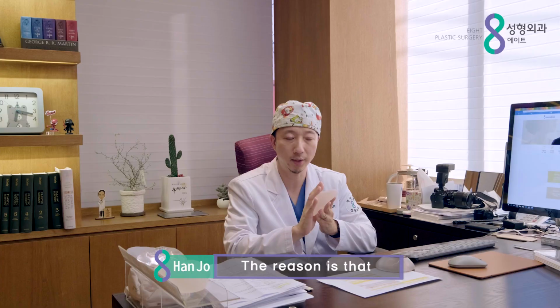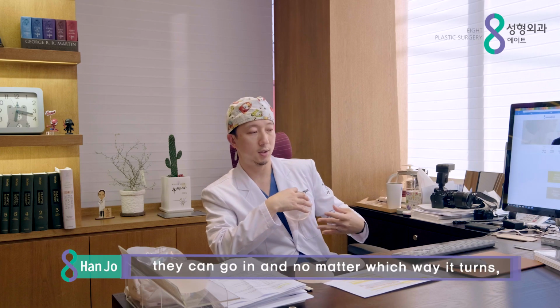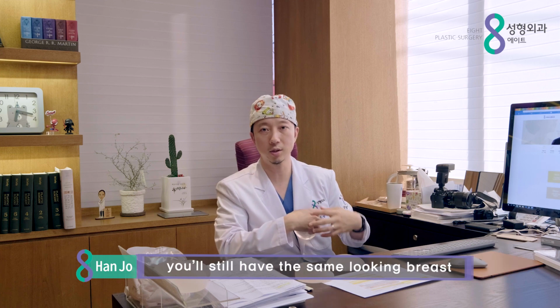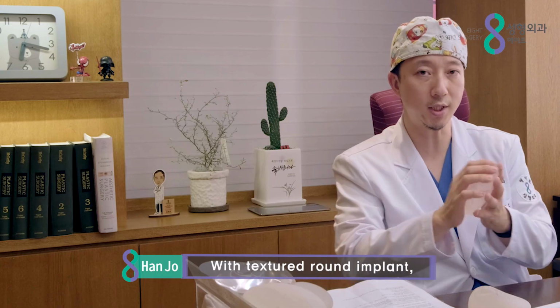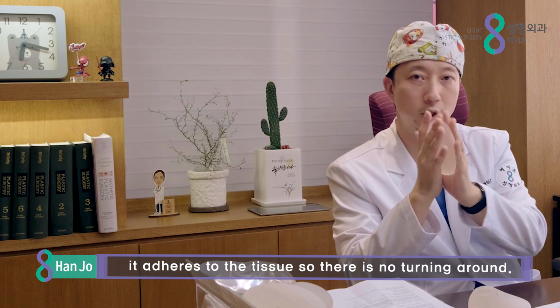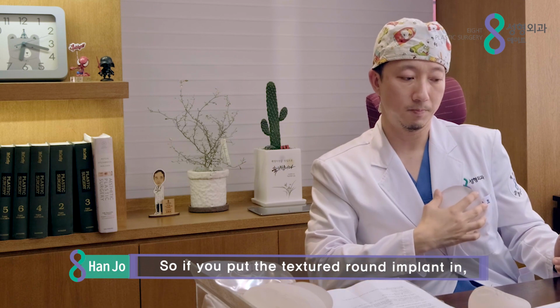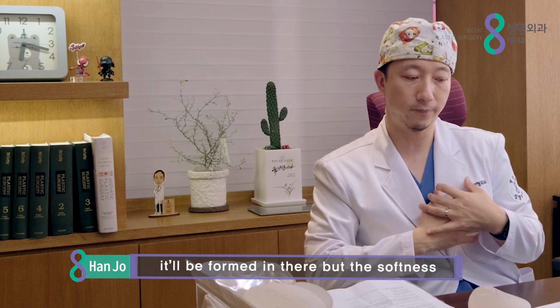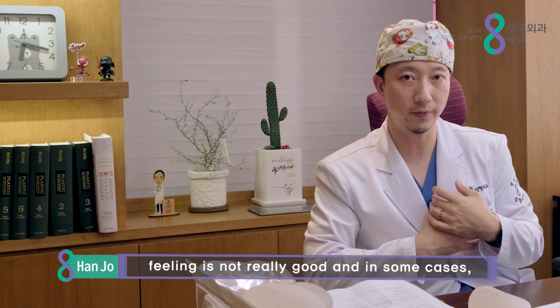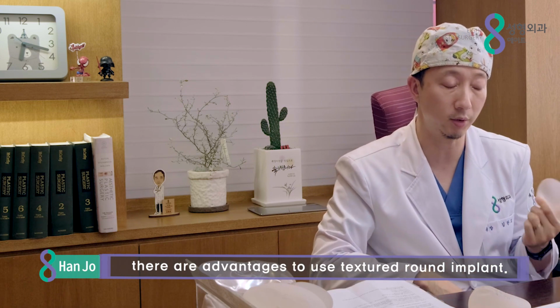There's only textured implant. The reason being is that with the round implant, it can go in and it will turn anyways and you'll still have the same looking breast. With the textured implant, it adheres to the tissue. So there's no turning around of the implant. So if you put a textured implant in, it'll be firmly there and softness-wise, it will not be very good. But in some cases, there are advantages to using a textured round implant.